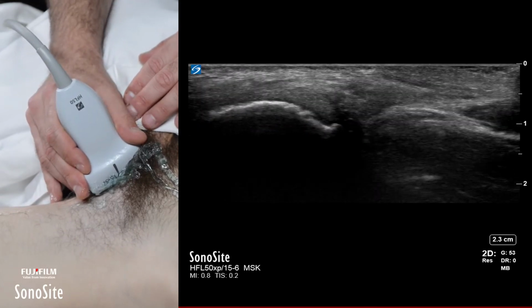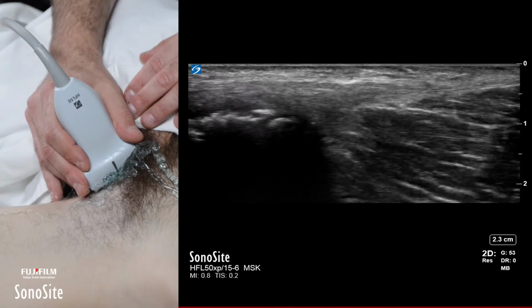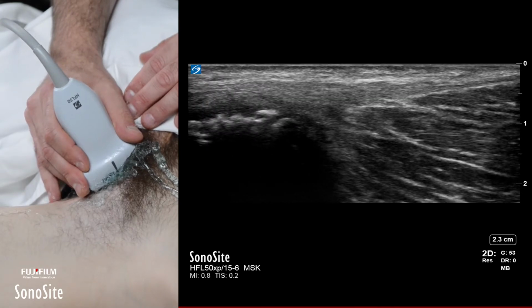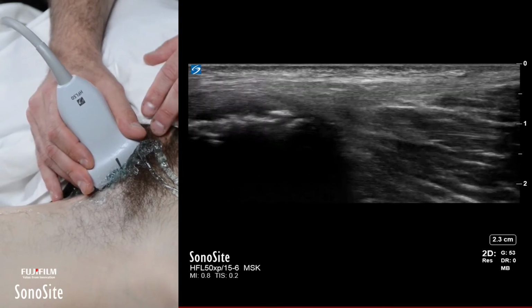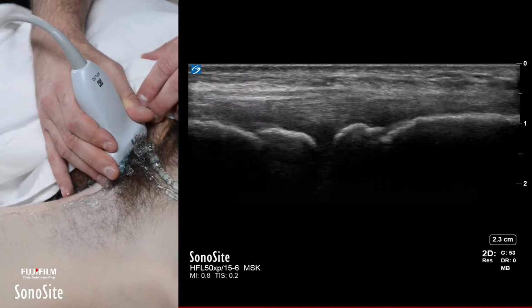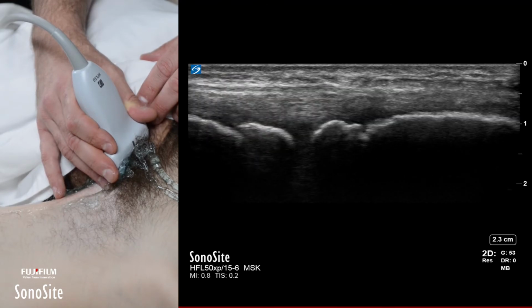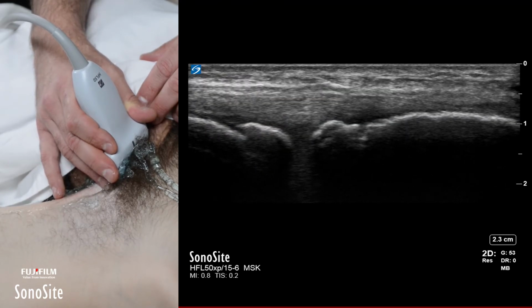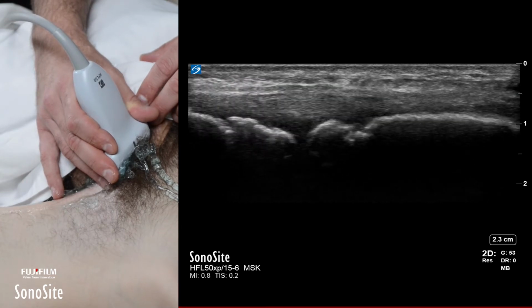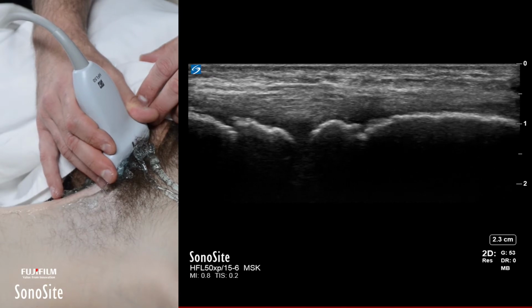Sometimes that can be concerning for an injury to the common aponeurosis of the adductor longus and the superior pubic ramus. However, when I go over and rotate and look, there's a symmetry there. So this may be developmental, and that little gapping often has the characteristic gapping that you see when somebody has some residual cartilaginous growth plate in that region. And this being a young patient, that's what I suspect.